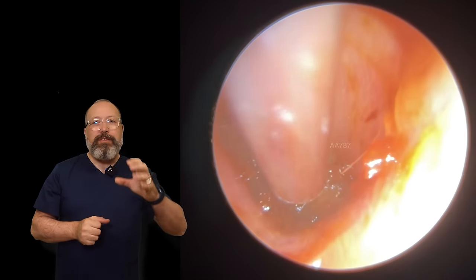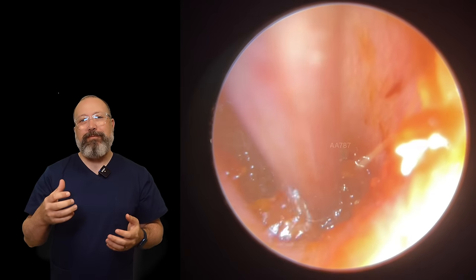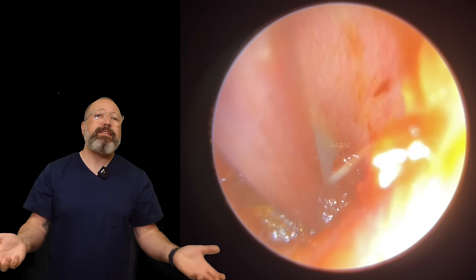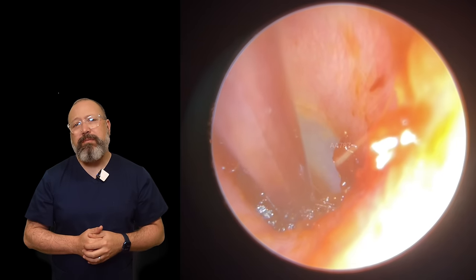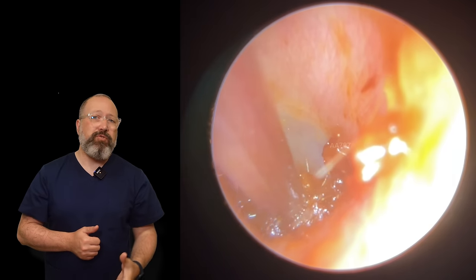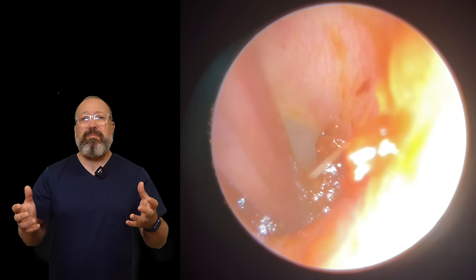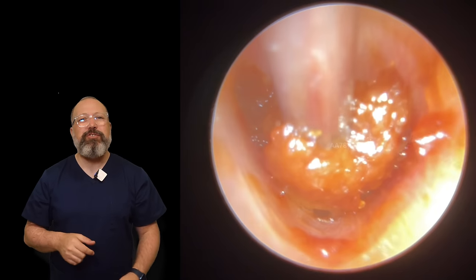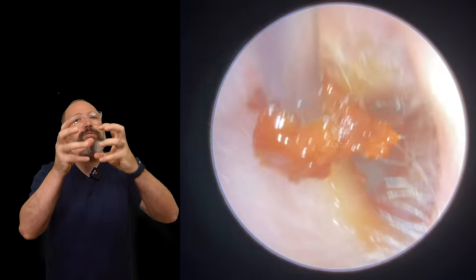Wax doesn't form this deep — it never forms as deep as on top of the eardrum. This has been pushed in. I understand why patients get desperate — they want to hear better so they resort to trying to get it out any way they can. A lot of patients will use a Q-tip or cotton bud, not realizing they're actually causing more problems by pushing it further in. When you get a grip on this smushy wax you can see the whole thing just lift and peel.